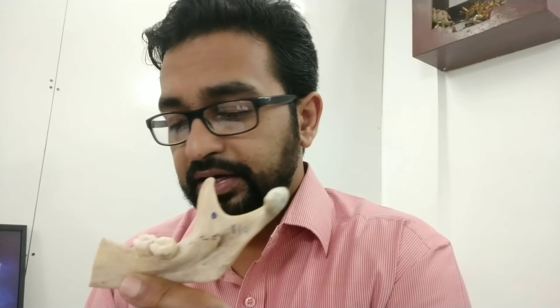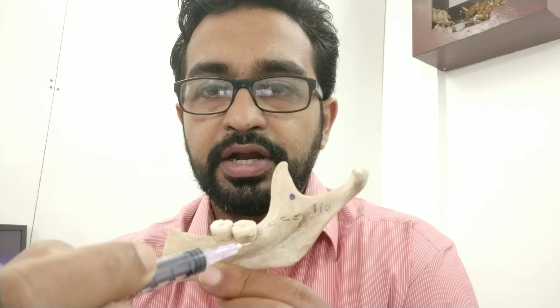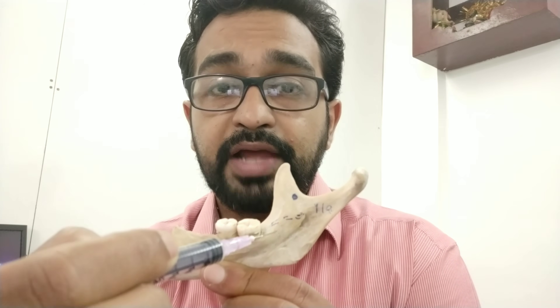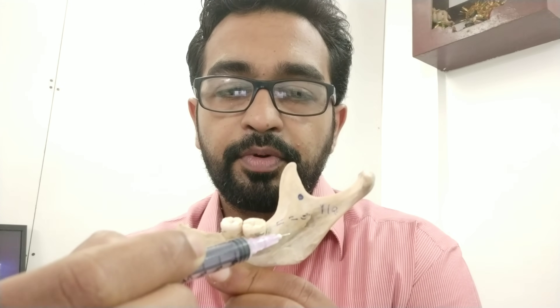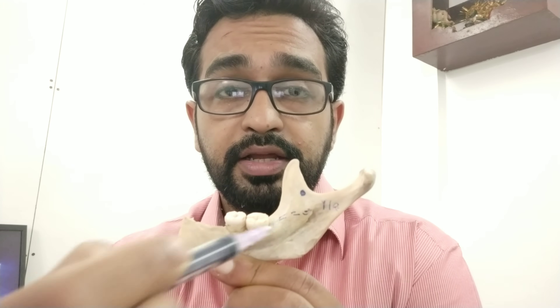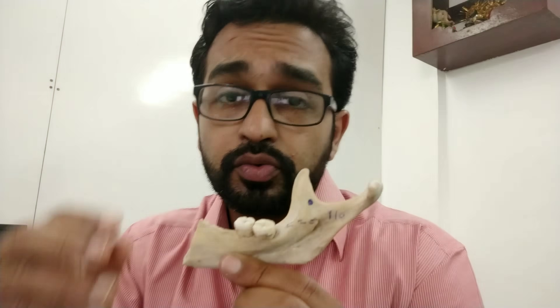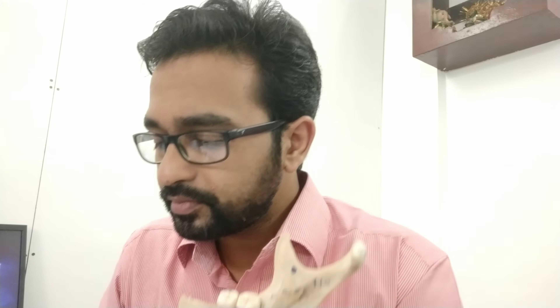For proper local anesthesia, 20 to 25 millimeters of the needle should be inside before you contact the bone — not too early. After contacting the bone, retract the needle one millimeter so you do not inject into the periosteum, then inject very slowly at a rate of 1.5 ml per 60 seconds. While retracting, also deposit 0.1 ml to anesthetize the lingual nerve.